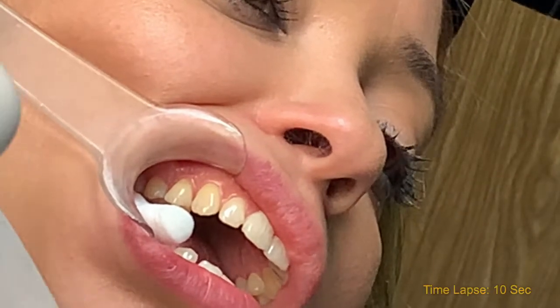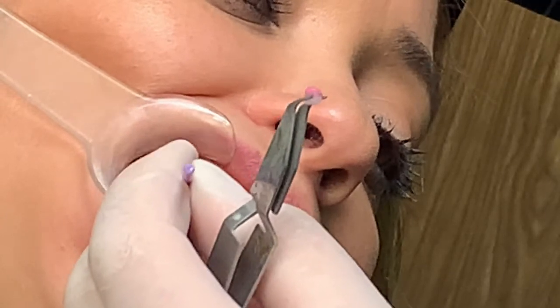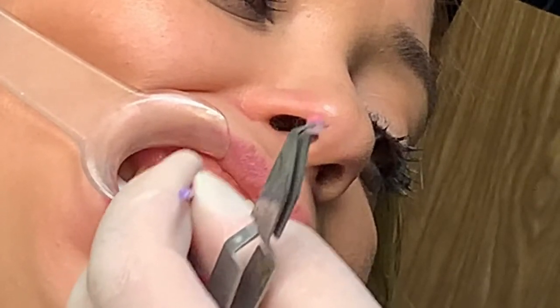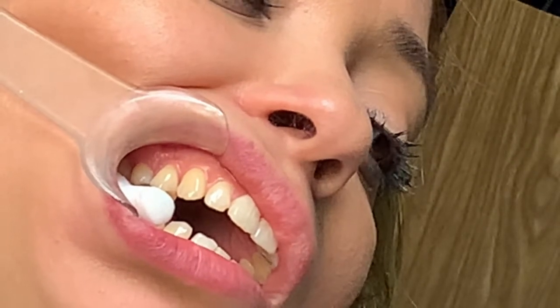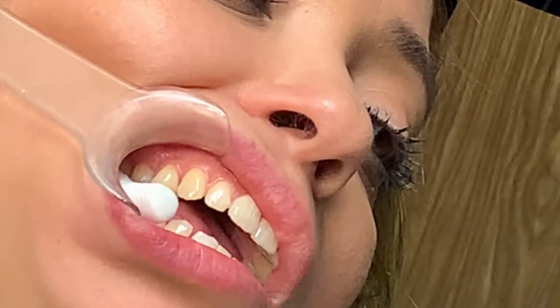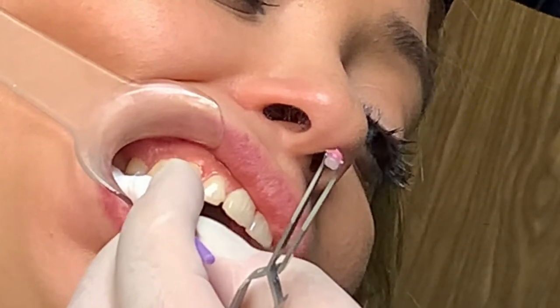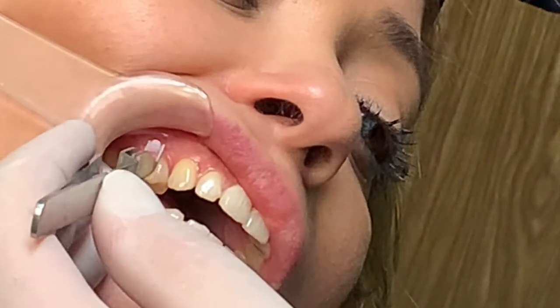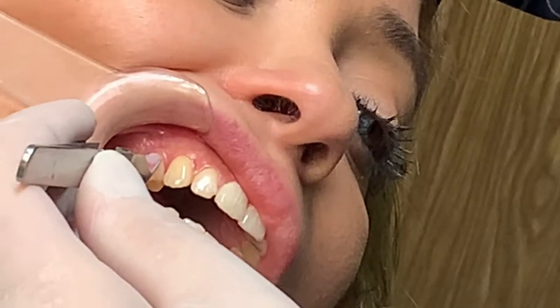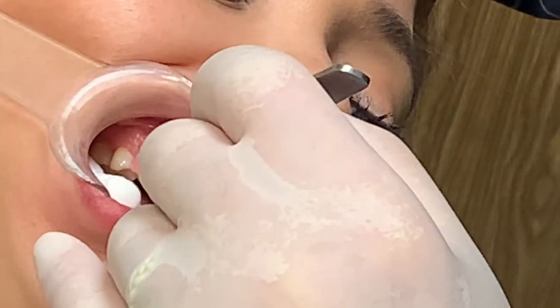Catalyst, please. I got it. Thank you. Ready. Okay, dip it in the well again. Do it again and hand it to me again. Very nice. Okay, here we go. Bracket. I painted both with the catalyst. I'm ready to go. I'm placing the tooth. Okay.